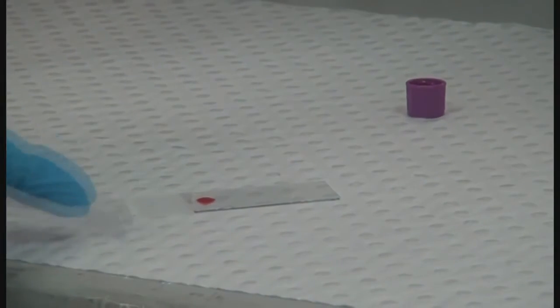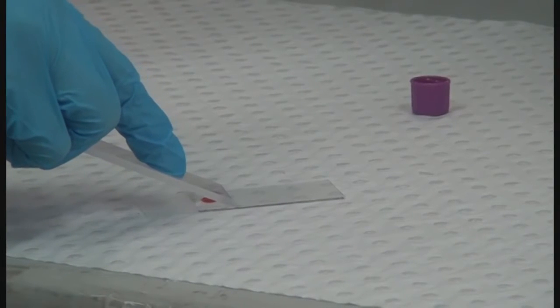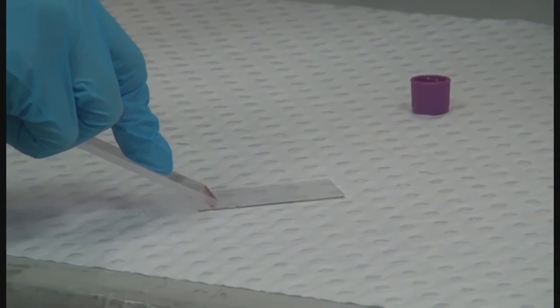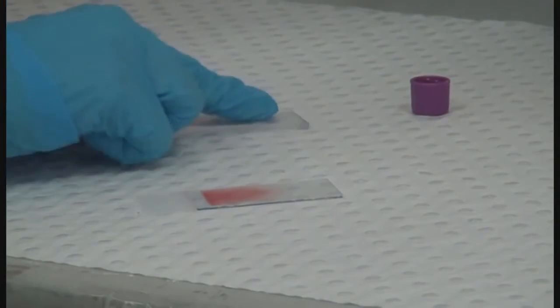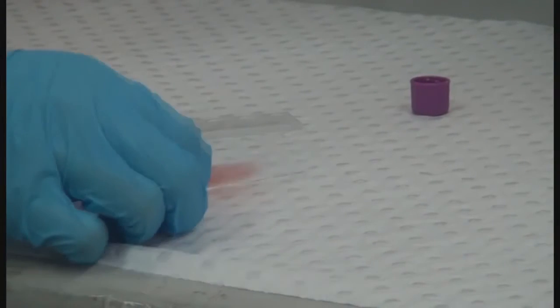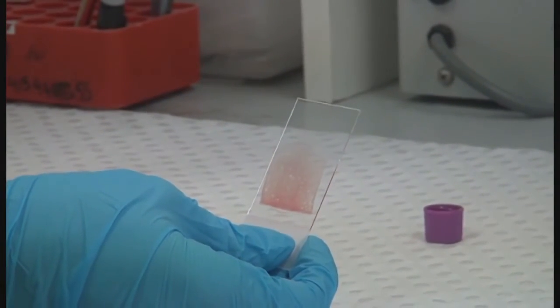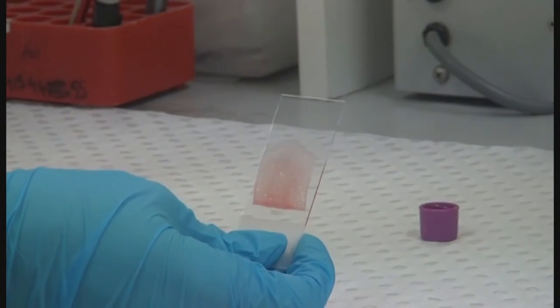Grab your spreader, hit the slide in front of the drop and pull it back to the drop. It'll spread across the spreader, and then a nice fluid motion forward until you hit the edge of the slide, and then you've got a nice smear. It's got a feathered edge, ends about halfway up the side of the slide, and that's how you make a blood film.